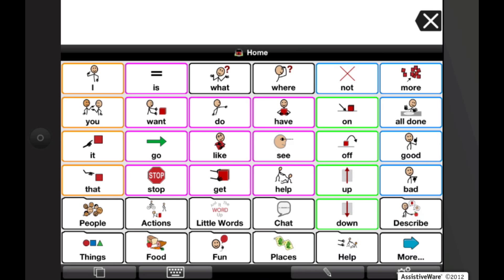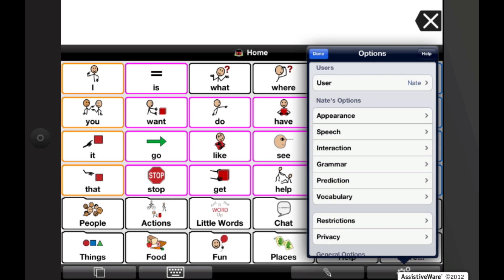To access the in-app guide in Proloquo2Go, open the Options View. To open Options View on an iPad, tap on the Options button, the Gears, on the bottom right of the toolbar.